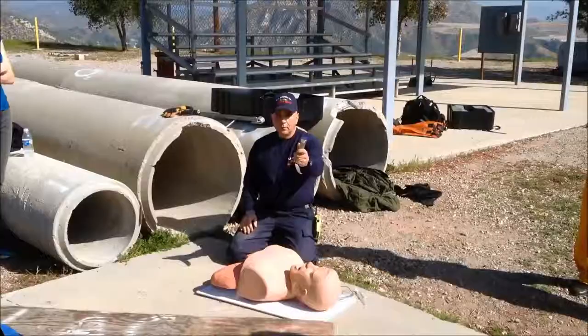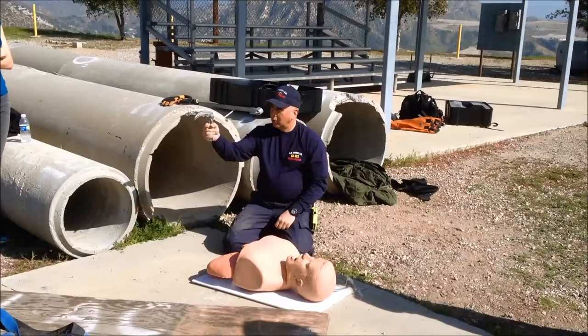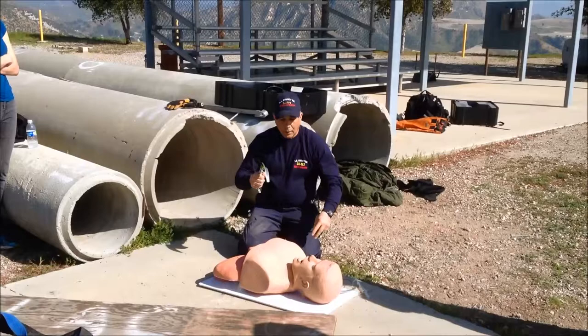How do you intubate face-to-face? Here he goes — upside down. Normally you need to go like that. So with your other hand, hold it like a hammer. Remember that, otherwise it gets too confused. Hold it like a hammer.